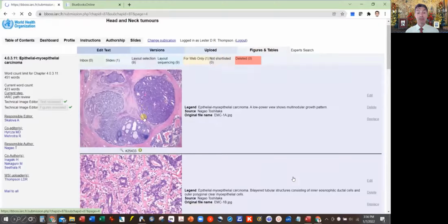But you can see here you are now, as the user of this book, able to drive a virtual slide that has been vetted by the group in order to be able to say, if I want to look at a true live case of epithelial-myoepithelial carcinoma, here is an example that someone else has looked at and agreed has the histologic features of that central luminal ductal component surrounded by the myoepithelial cells. So that is one of the really fantastic findings in this book.